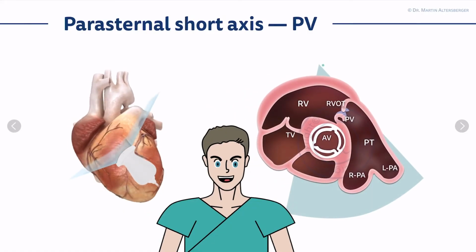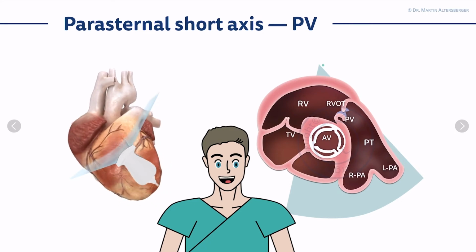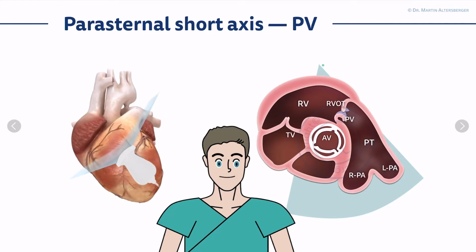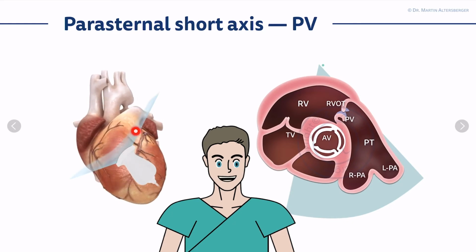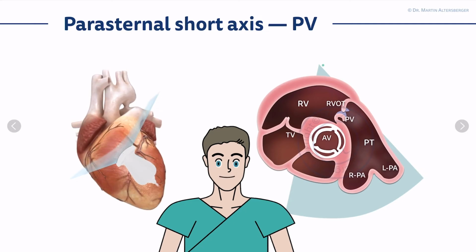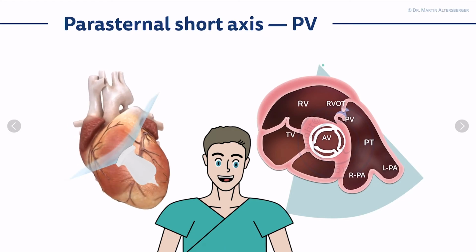The next view we have to focus on is a distinct view of the pulmonic trunk and the pulmonic arteries. How is this done? Well, you can see it in this graphic over here that we always cut through several planes of the short axis view. For the pulmonic trunk and the pulmonic arteries, the marker of the transducer doesn't point towards the left shoulder, but more towards the head of the patient to really fit into the pulmonic trunk. Well, how is this done?